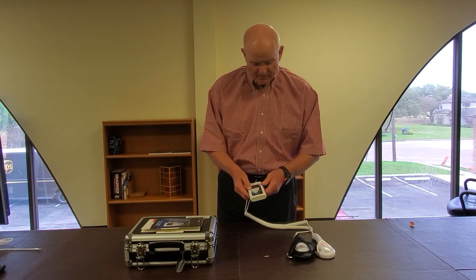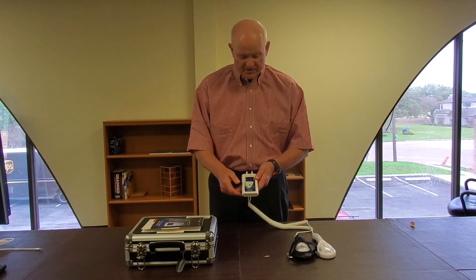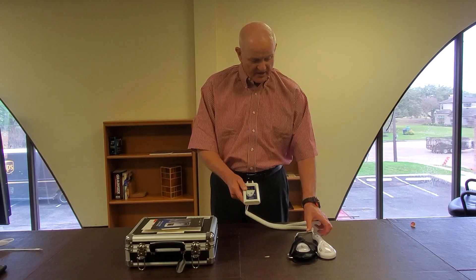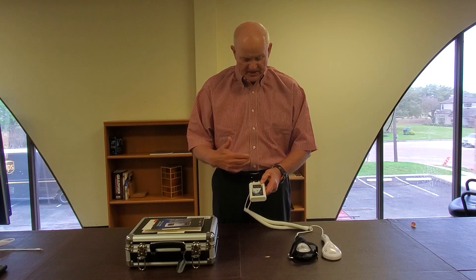Now, if for some reason the beeping bothers you or the patient, the 3 o'clock button will deactivate the beeping. I've deactivated the beeping — the laser probe is still flashing and it's still counting itself down.